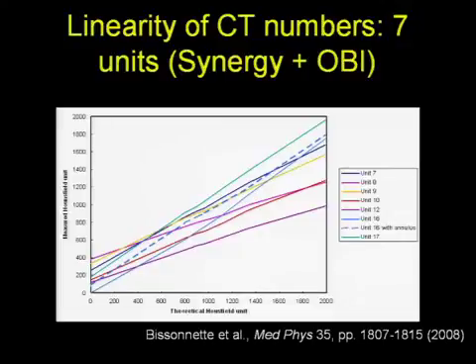If people, for some reason, want to use cone beam CT images for planning purposes, they will be geometrically accurate. CT numbers may not be, so I would advise them to use bulk density correction and perform those calculations on these rather than on CT numbers.